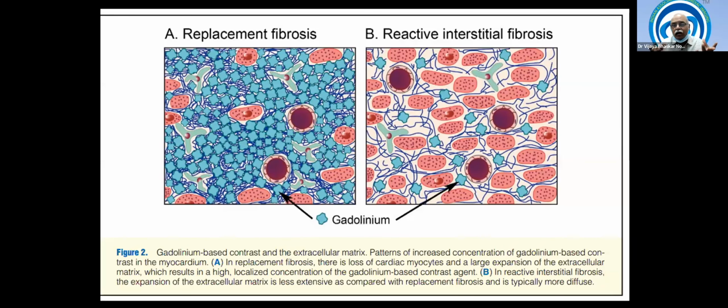of the diseases which are being now taken as the, what you call, heart failure with preserved ejection fraction. This is where we have diffuse infiltrative disorders, diffuse fibrosis in the interstitium, and that is what T1 mapping is going to look at and diagnose, identify, prognosticate.